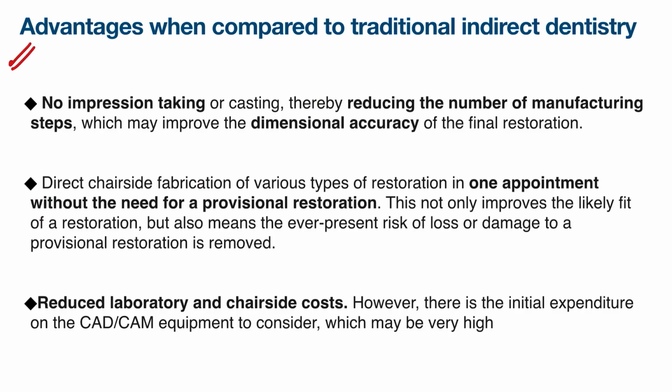Coming to the advantages of digital impression, there is no impression taking or casting, so it is reducing the manufacturing steps. Also, there is direct chairside fabrication of various types of restoration in one appointment without the need of any provisional restoration. It reduces the laboratory and chairside cost. However, there is initial expenditure on the CAD/CAM equipment to consider.